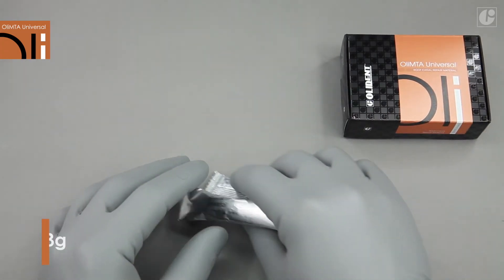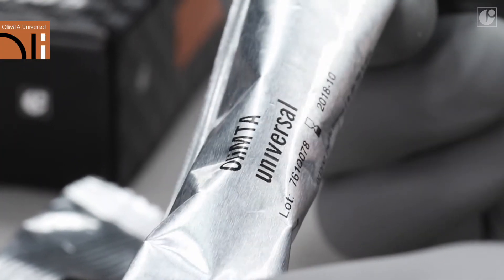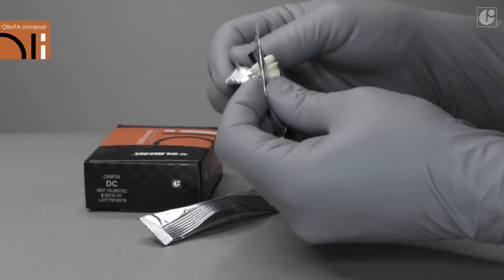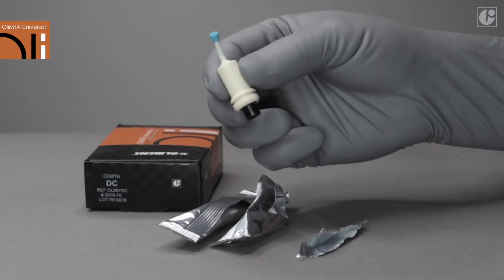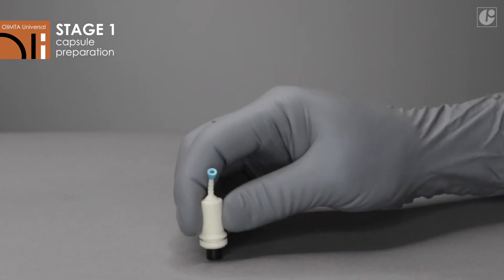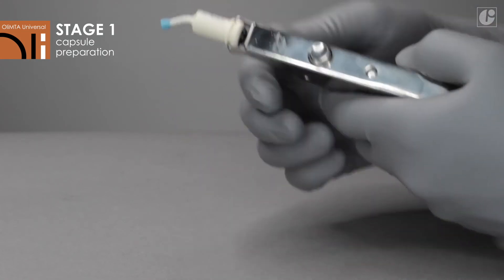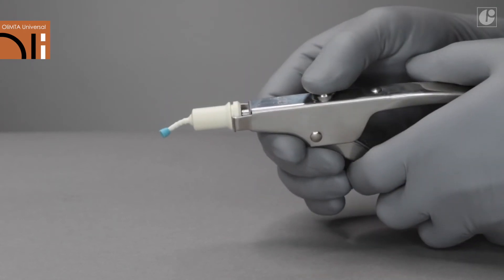OliMTA Universal's packaging contains two capsules with the material. Press the black piston located at the bottom of the capsule against the tabletop. Place the capsule in the applicator and press the trigger once — you will hear a click — then move the capsule to the mixing device.